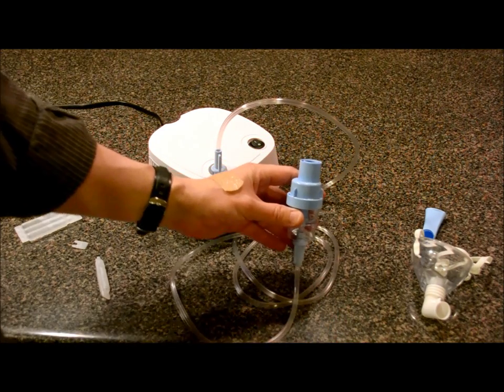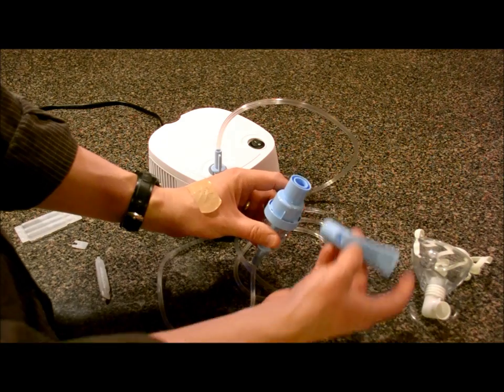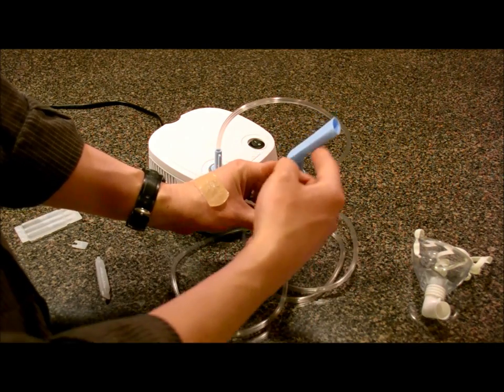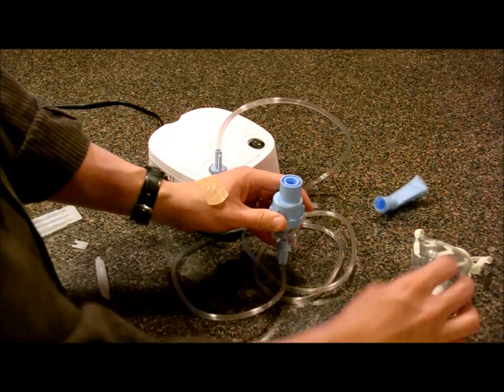On the top you have two types of delivery methods. For your older kids or an adult, you can just put the mouthpiece in your mouth and as the pump runs, it'll vaporize or nebulize the medicine and they'll just breathe through that.